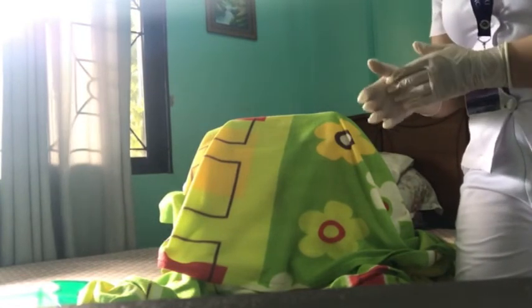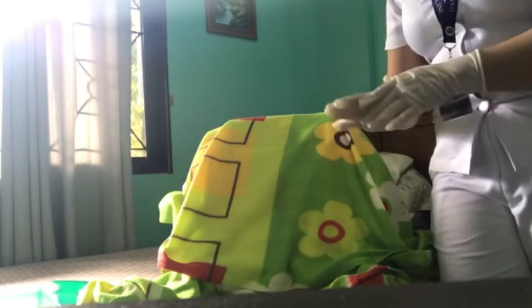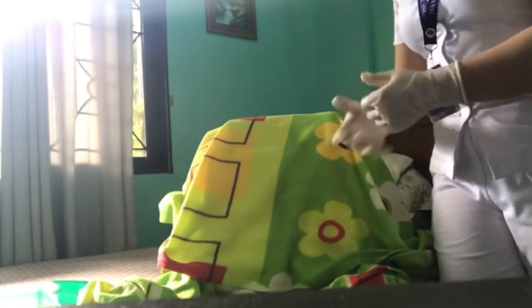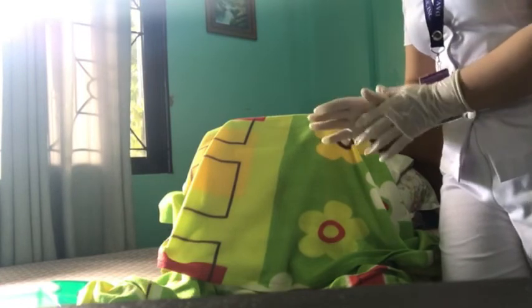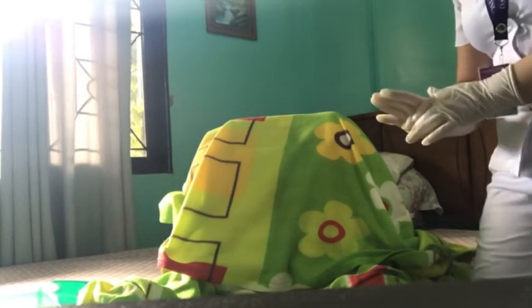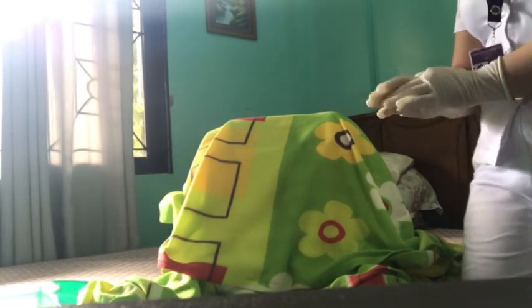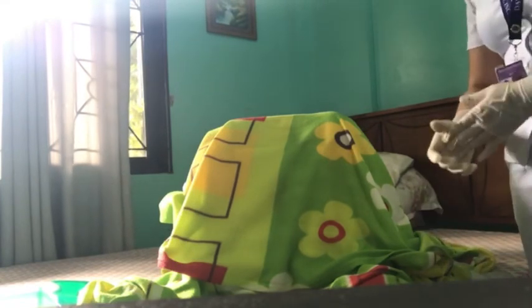For the documentation of urinary catheterization, we should always include the date, time of the procedure, and the type and size of the catheter used. In my case, I use a two-way Foley catheter, latex silicone coated. Its size is 14 French. Also record the amount of fluid used to inflate the balloon, wherein I use 10 cc of sterile water, and also document the character and amount of urine from the urine bag, the reaction and response of the patient, and other significant observations.